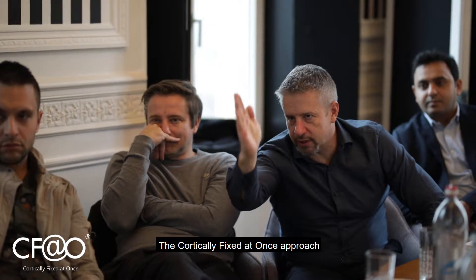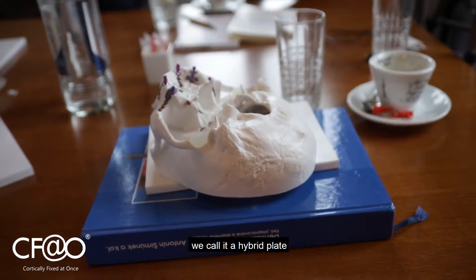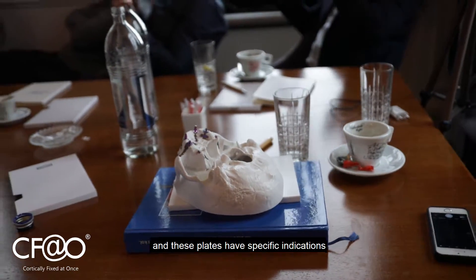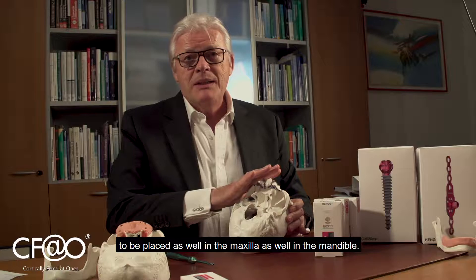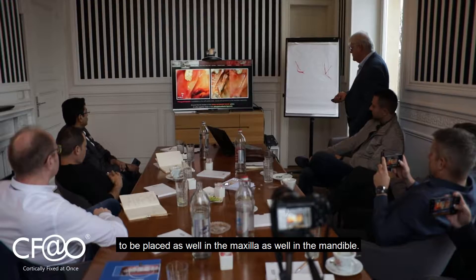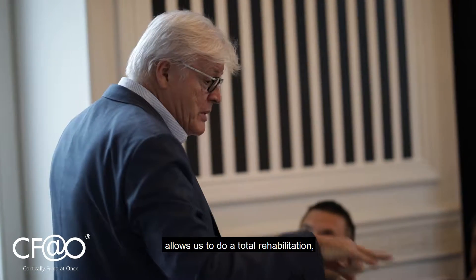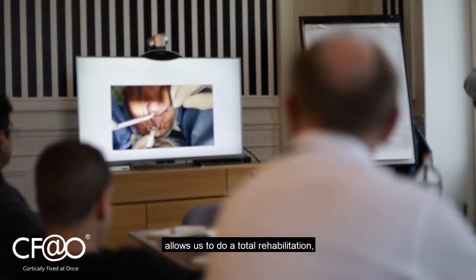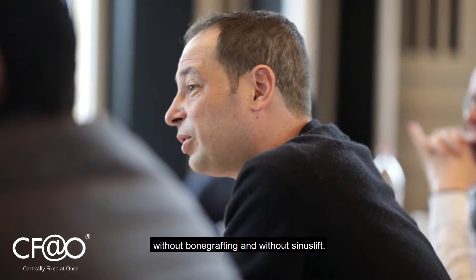The cortically fixed advanced approach contains four different plates — we call them hybrid plates — and these plates have specific indications to be placed in the maxilla as well as in the mandible. The cortically fixed advanced system allows us to do a total rehabilitation and immediate loading without bone grafting and without sinus lift.